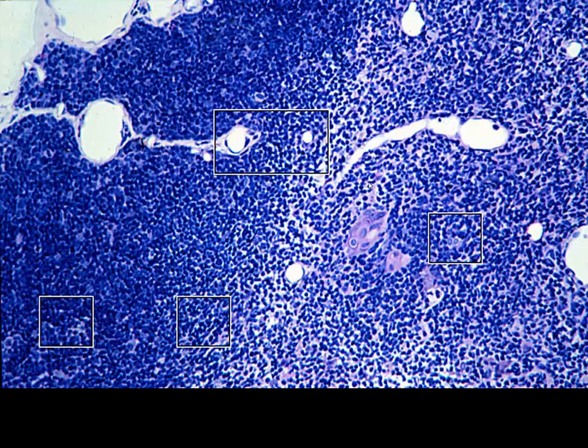Once again, just looking at the cells that we have present here, these are going to be some of the reticular cells, not necessarily a Hassall's corpuscle, but we're going to be looking at some of these areas in higher magnification as we look at the most dense in the cortical region. We look at some lighter areas as we move into the medullary region and sort of a paracortical type of region.